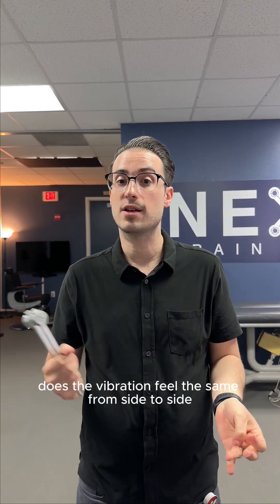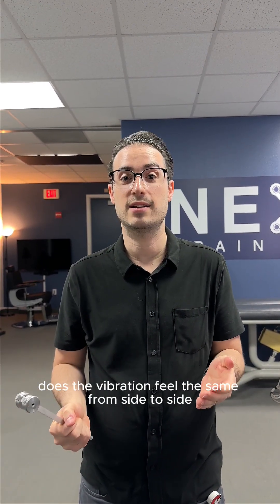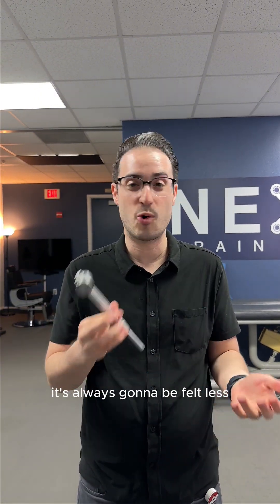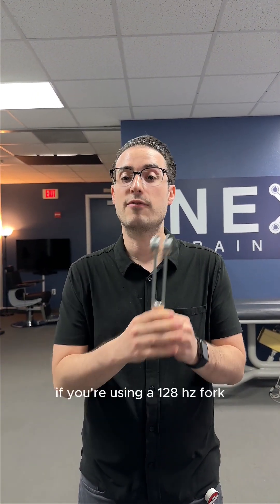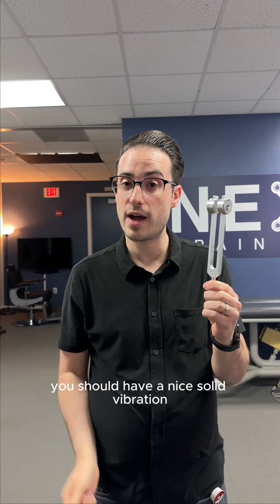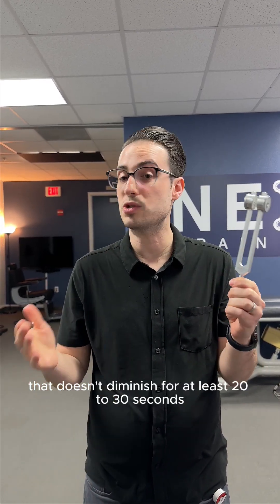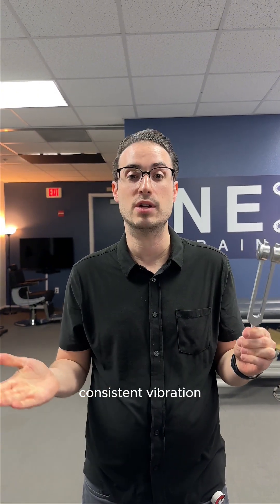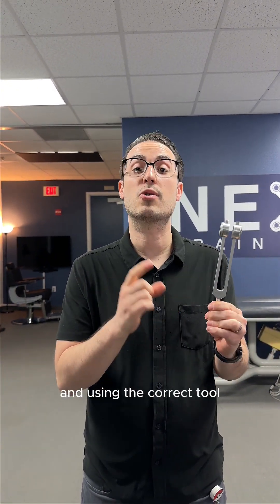The whole purpose of this test is to see whether the vibration feels the same from side to side. If you're holding it by the prongs, the second time you do it on the other side it's always going to feel less. With a 128 hertz fork, you should have a nice solid vibration that doesn't diminish for at least 20 to 30 seconds, giving you a consistent result if you're using the correct tool.